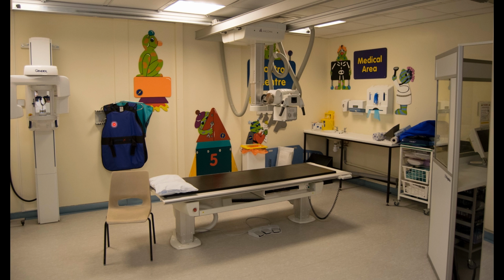These are your lead gowns on a reinforced coat hanger, because they do weigh a lot. I think they weigh in the region of... I don't quite understand how the stone systems work, but I do remember that it was between 1 and 2 stone, depending on the millimeter equivalent thickness of lead that is in there. These are lead-free as far as I know. I'm not quite sure what other chemicals they have in them to stop radiation, but they do, or it's lead-impregnated rubber, or sometimes barium.